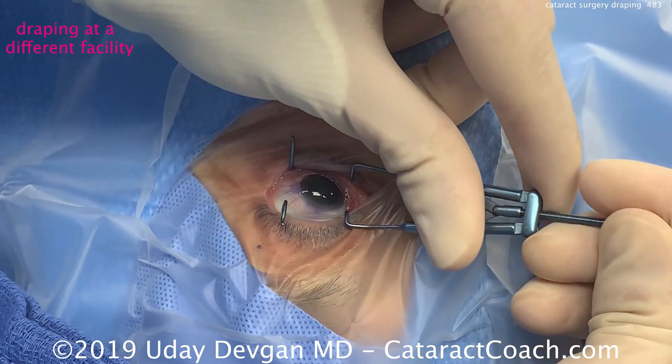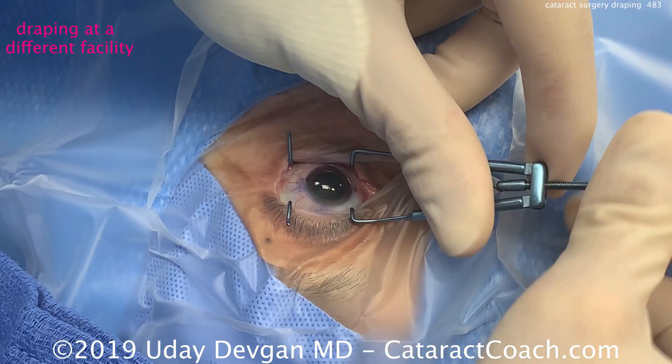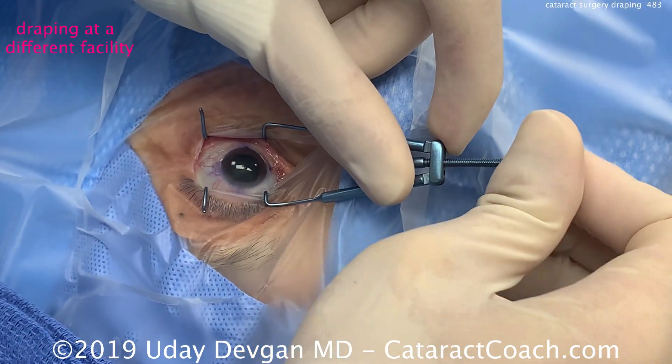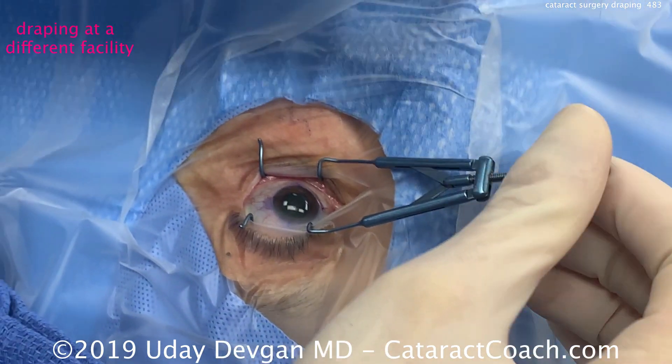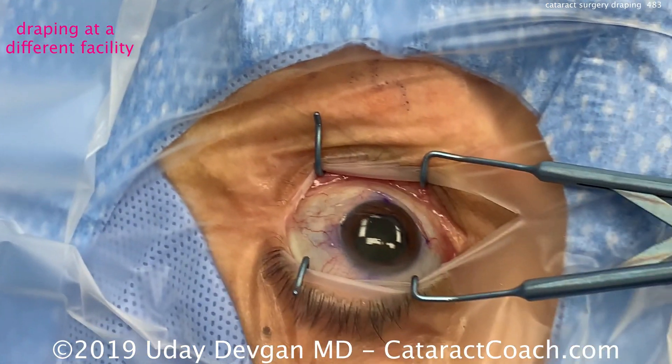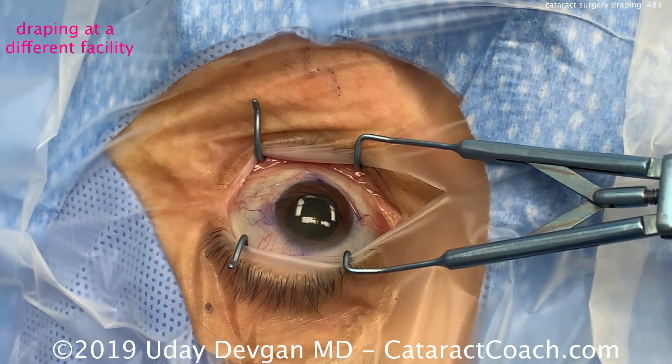I'll zoom in here to show you that view — he's adjusting his speculum and that looks great. Good exposure, again completely isolating the eyelash margin. I think that's the key for our surgeries: it avoids contamination by oil and debris.